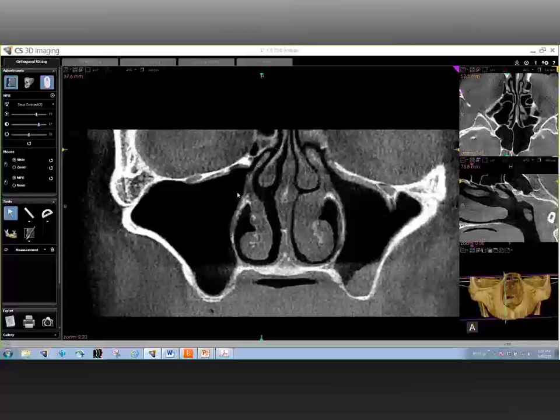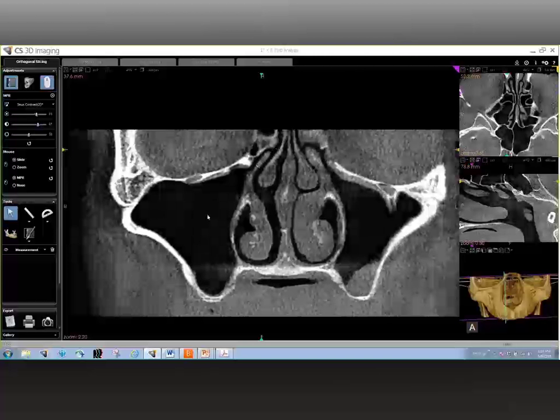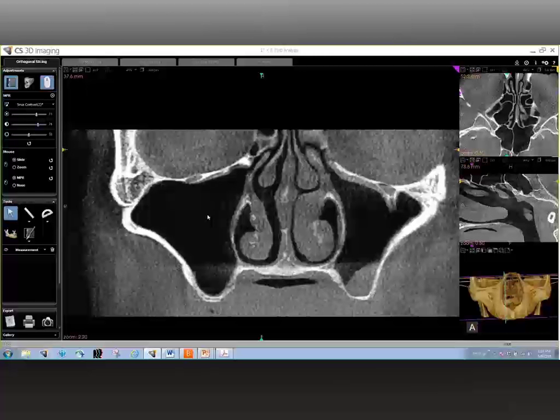Now keep in mind, sinuses are not sterile areas. But when you have the ostium open, it shows that the sinus is fairly healthy. And if the ostium is blocked, it is a sign of chronic sinus disease of any nature. It could be of varied nature. I mean, there's no one thing to it, but you have to further examine the patient for any other chronic diseases, or acute even.